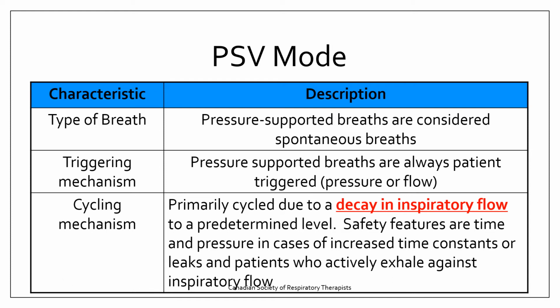So typically it's some sort of minimum pressure support, anywhere between 0 to maybe 8 centimeters of water pressure for support, a normal level of PEEP, and we put the patient into the supported mode with the determined amount of support that's required, and we see how they do. We see how they breathe. And if they're able to maintain sort of normal parameters, then we may consider, yes, now it's time that we can liberate this patient from the ventilator.